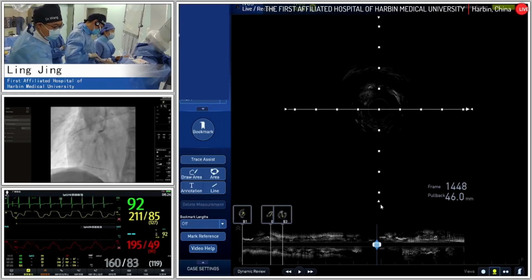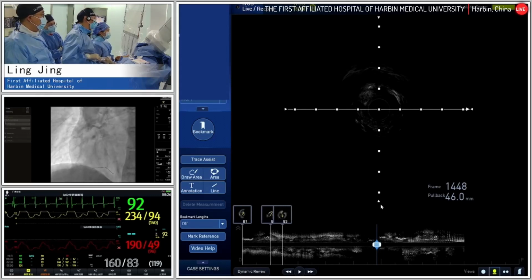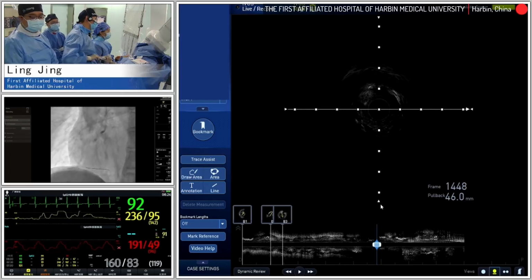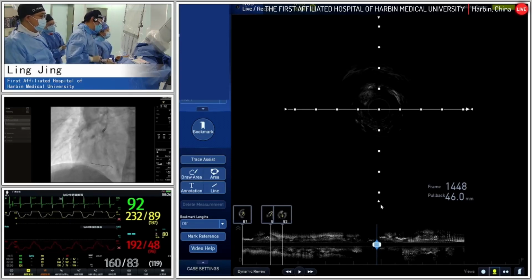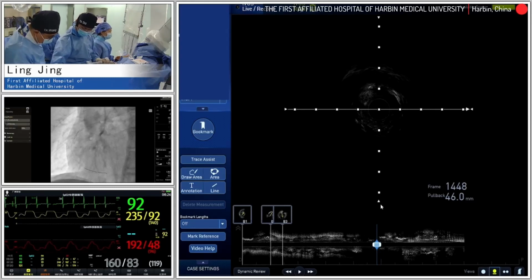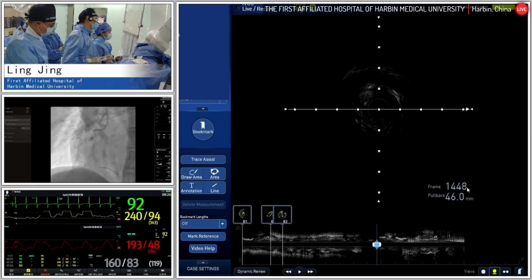For example, not only to offer some support to the antegrade wire, but we can also perform tip injection, wire cutting technique, and guide the retrograde wire, etc. It's all of great potential use.